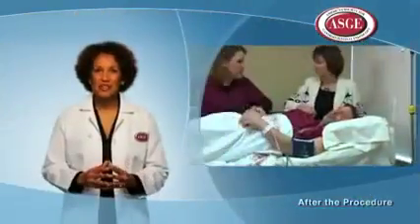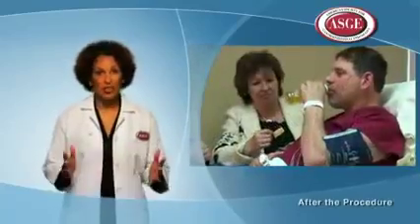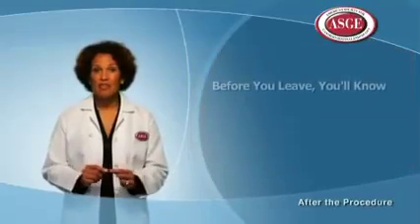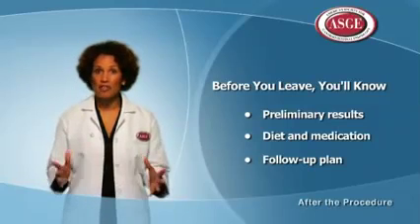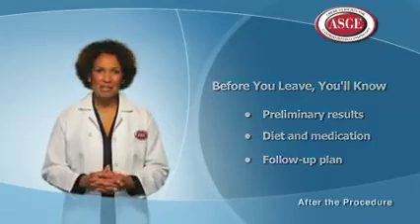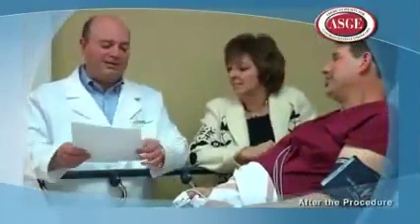After your procedure, you'll be closely watched for about 30 minutes. You'll be allowed to have something to drink and a light snack immediately following the procedure, and you can generally resume your normal diet. Someone from the team performing your colonoscopy will speak with you before you leave and will go over the results of the test, as well as any medication changes and the follow-up plan. Before you leave, you will know at least the preliminary results of your exam.